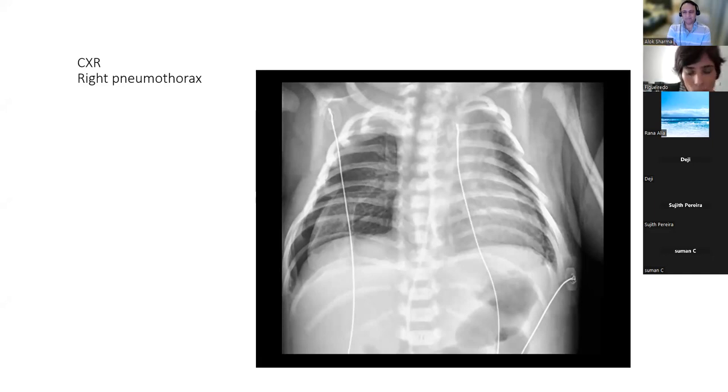24 hours after, he was doing well, and the FiO2 needed was 0.25, and clinically it was more stable. Yeah. Lovely. We didn't need to aspirate or not. Amazing. That's a beautiful scan. My compliments. That's a really nice scan. Well done. Thank you. What do others think?